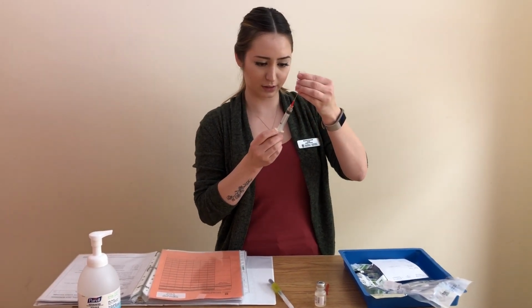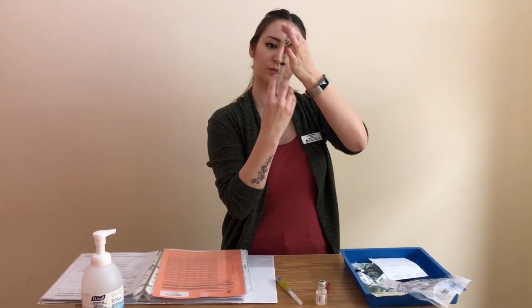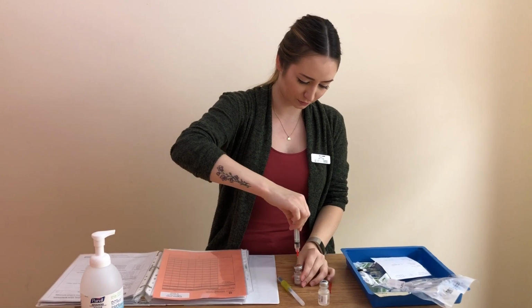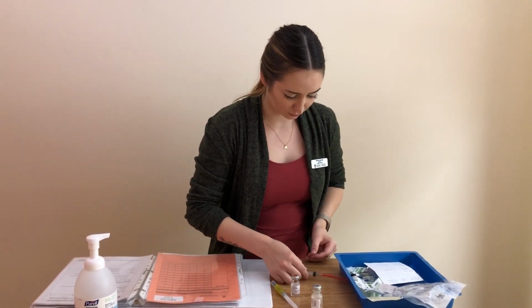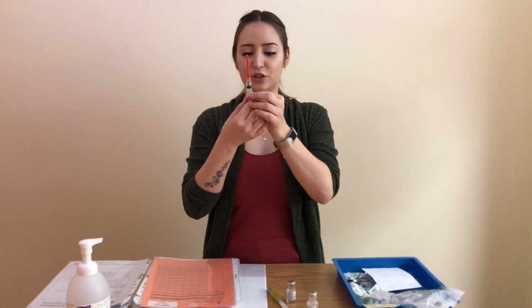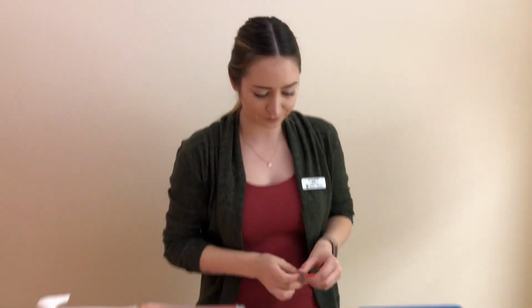And pull up 1.2. So 1.2 milliliters of the methylprednisolone there.